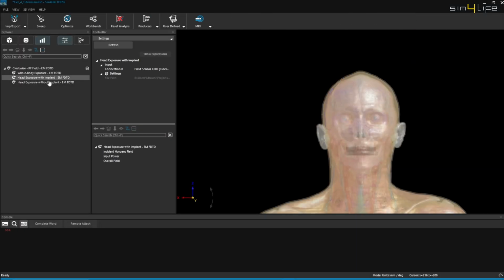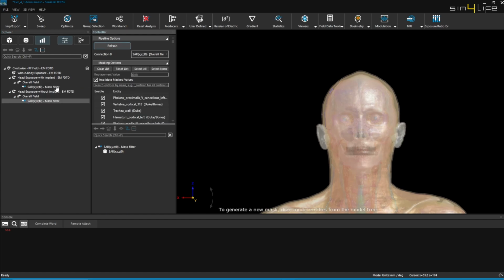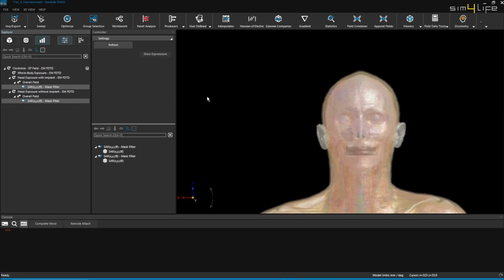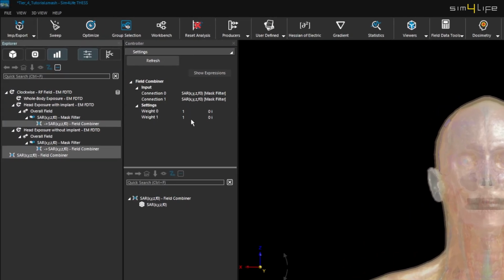In the Analysis tab, for both simulations, with and without the implant, navigate to Overall Field, then Sensor Extractor, and finally SAR. Select both simulations, starting with the one with the implant, followed by the one without the implant. From the ribbon, choose Field Combiner. Set the weight of the real part for the second field to -1 and hit Refresh.